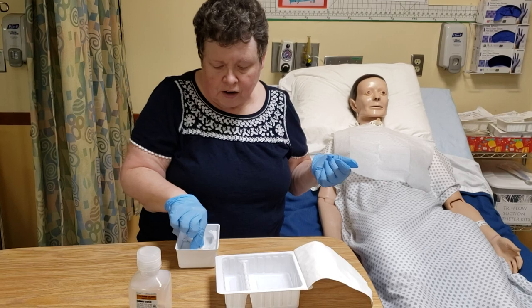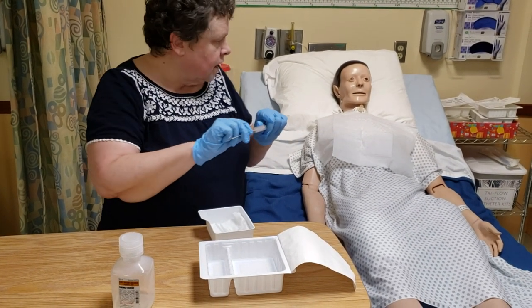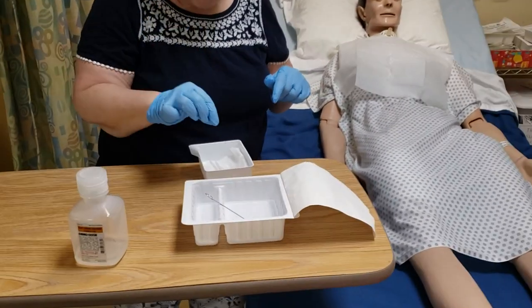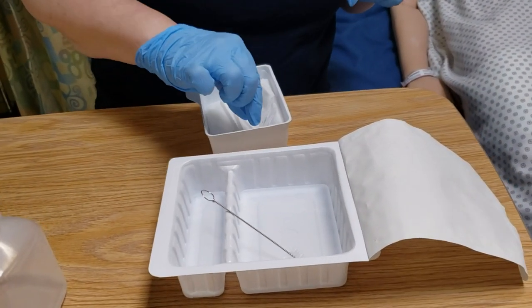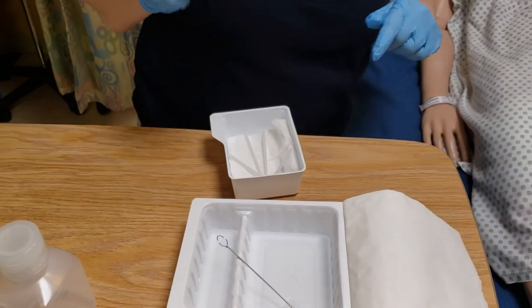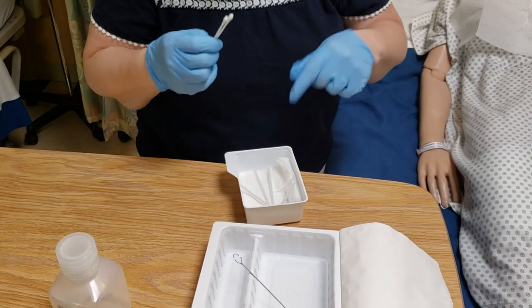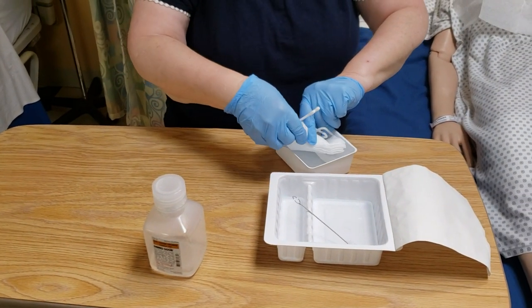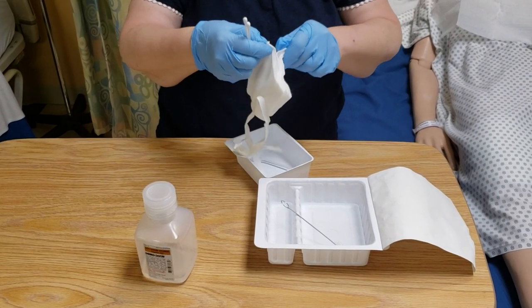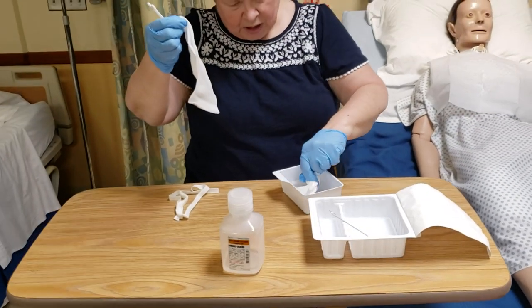Now we can go ahead and dig into the kit. If we were going to be cleaning the cannula itself, we would use a little brush. We have some pipe cleaners, some Q-tips or little swabs, a dressing, a new drape to put under, and some 4x4s in here. Without getting things too contaminated, we can set those aside.